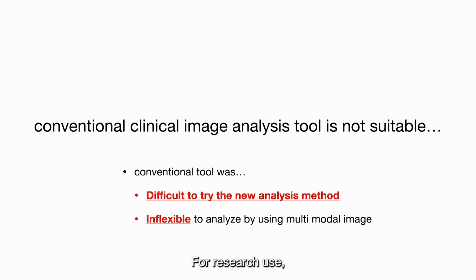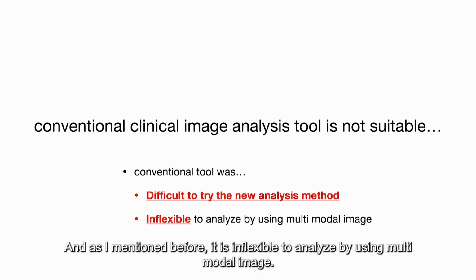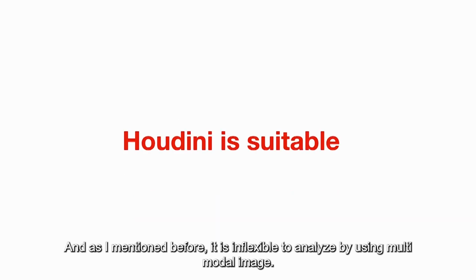For research use, the image analysis tool we use in the clinical environment is not suitable. Certainly, the image analysis tool is useful for widely used methods, but the tool is hard to use to try a new quantification method. It can only be used for certain purposes. And as I mentioned before, it is inflexible for analysis using multi-modal images.